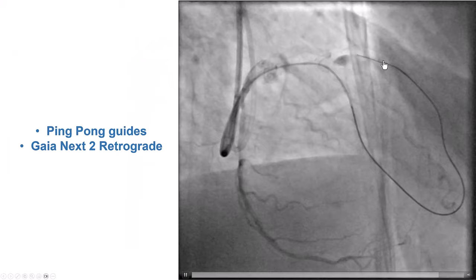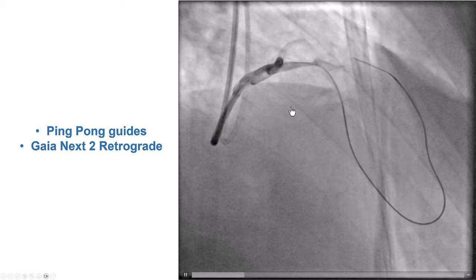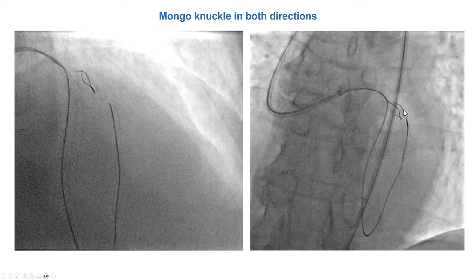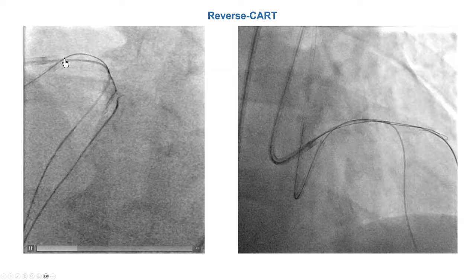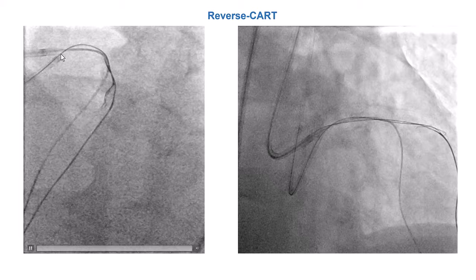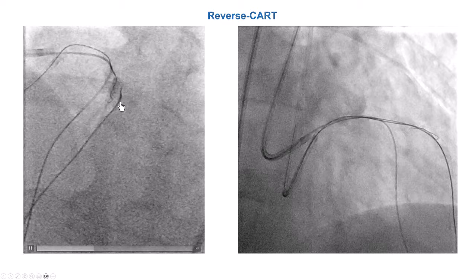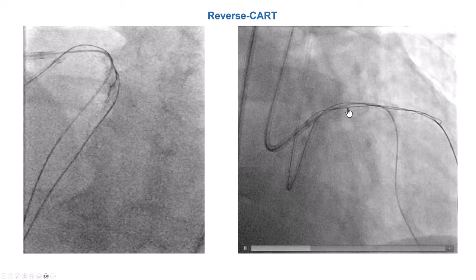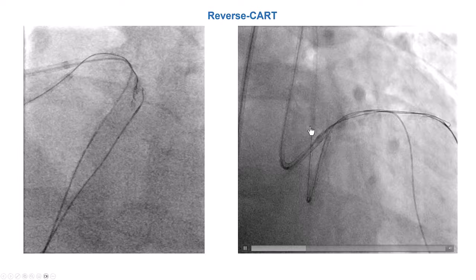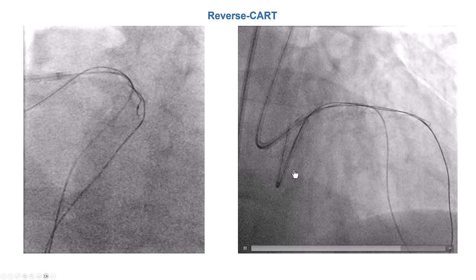We used a Gaia Next for retrograde crossing, which advanced partially, but we had difficulty advancing it further. We then used a Gladius Mongo in both the antegrade and retrograde directions. Typically for LAD CTOs, we advance a guide extension into the mid or proximal LAD so that there is no inadvertent subintimal or extraplaque entry of the retrograde guidewire into the left main. In this case, the retrograde Gladius Mongo, once we performed the reverse CART, advanced very easily throughout the LAD into the second guide catheter. We used two separate guides rather than externalizing through the same guide, even an 8 French, as it is much easier.